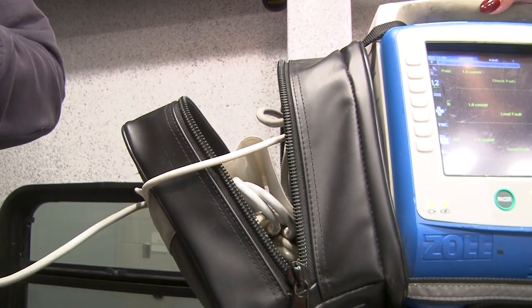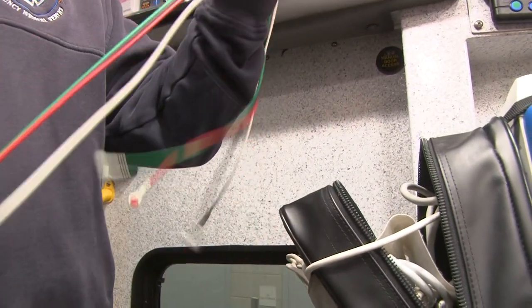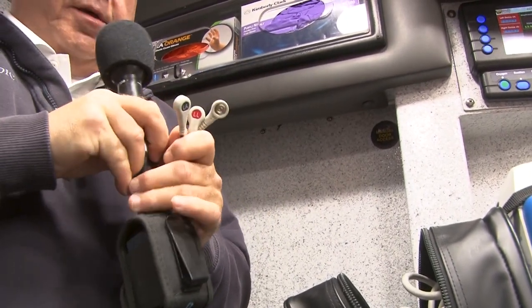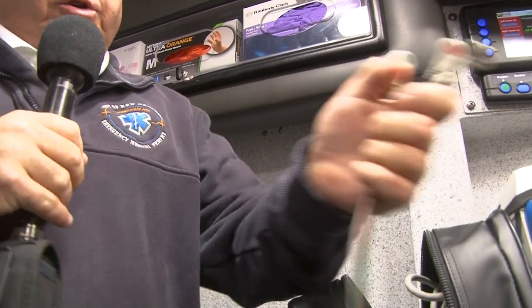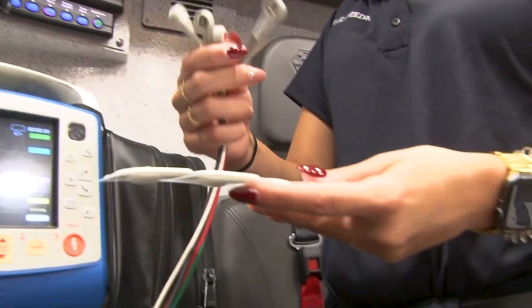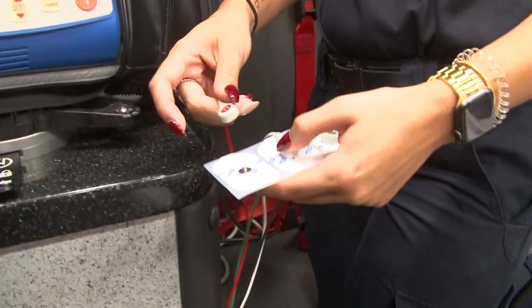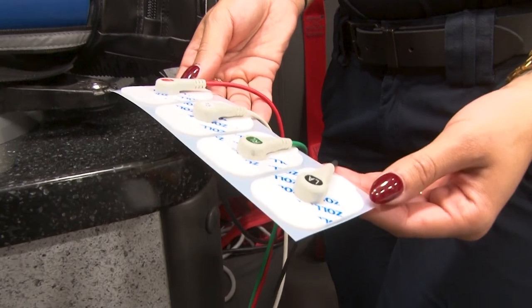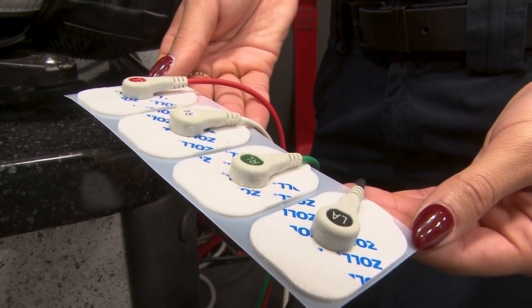It also has what they call EKG leads, which are basically just a bunch of wires, and they attach electrodes to the end of these wires, and they place them in a particular order on a patient's chest, and they're able to get a picture of a patient's heart. They're able to see how fast the heart is beating or how slow. They're able to see whether the rhythm is regular or irregular. And they're able to see some other aspects of someone's heartbeat.